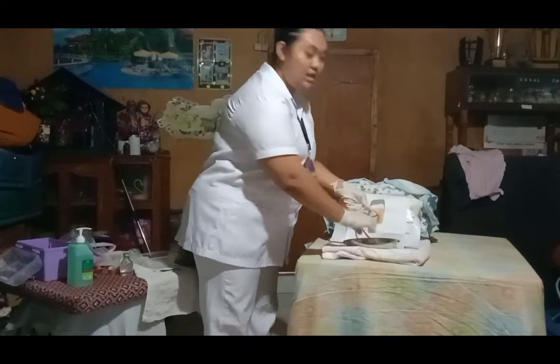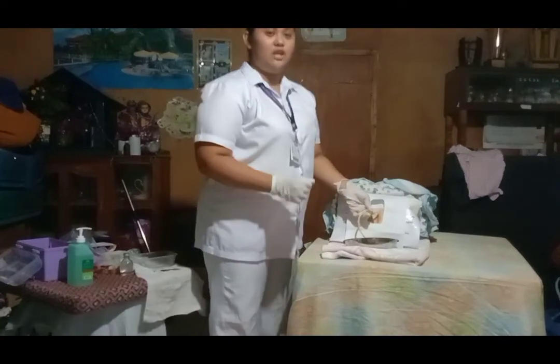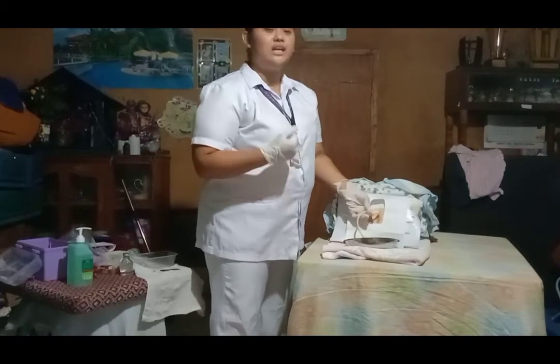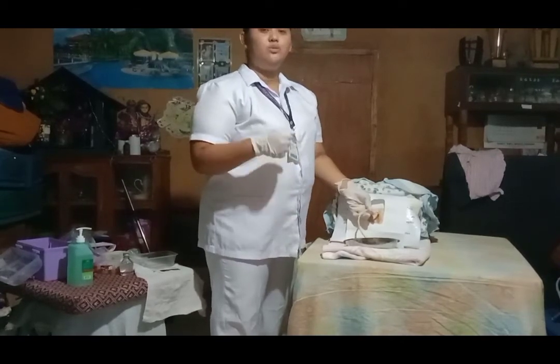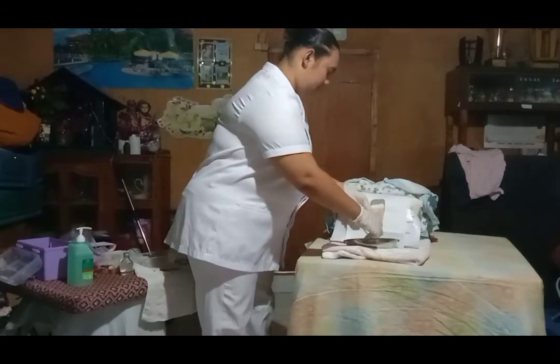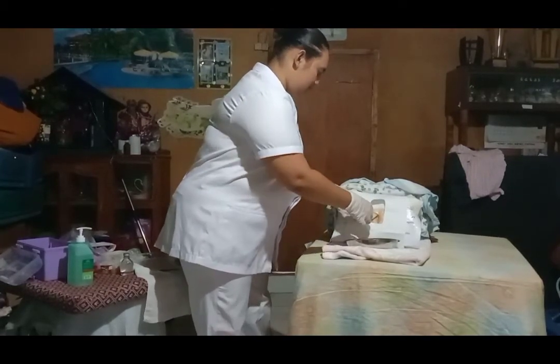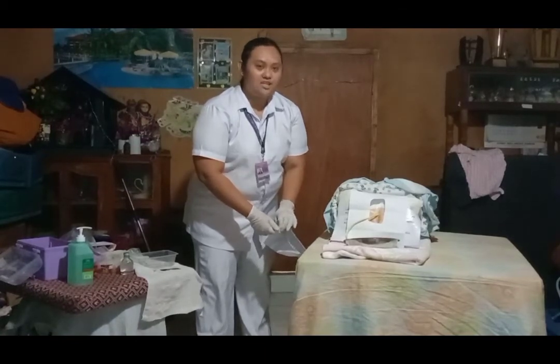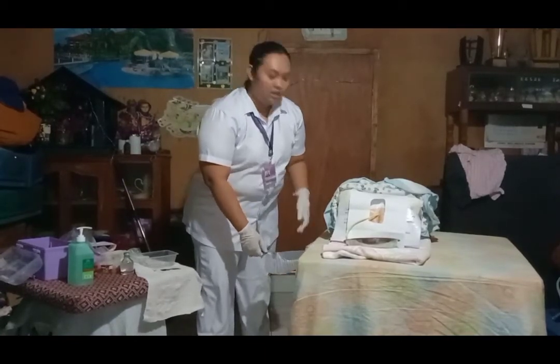So, connect the catheter to the urine bag. The urine bag is equipment used in partnership with the catheter. It will be the one that collects the urine from the patient. But first, we need to ensure that the urine bag is closed to avoid leakage and maintain the sterility of the connection.